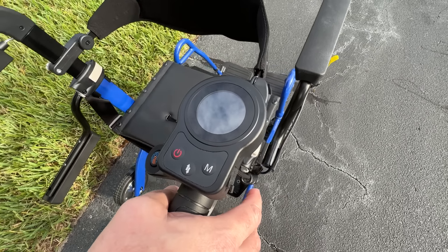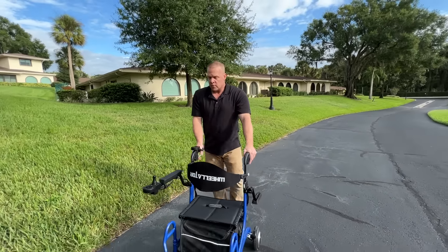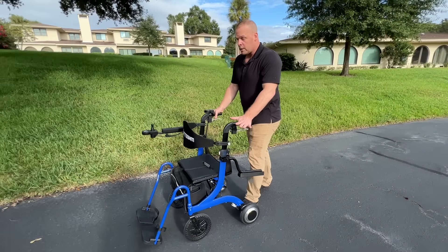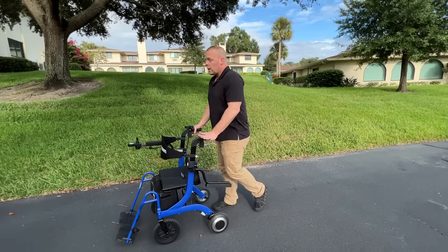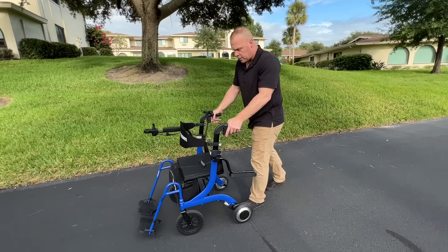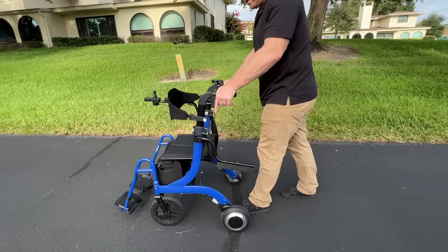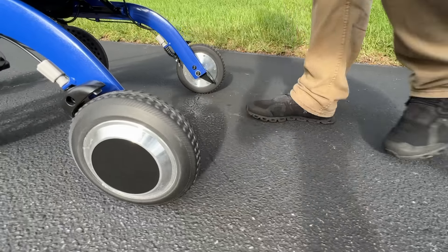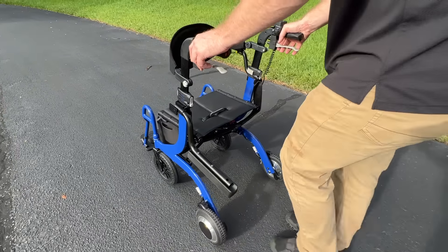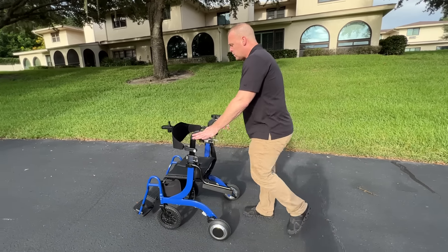Let's imagine it's a beautiful day. It's been raining for the last few days and I just want to use a regular walker. The doctor said it's a good idea for me to be walking and getting exercise, and that's exactly what I want to do — walk as much as I possibly can. You can kind of see this is flat ground right here. Each of those rear wheels has a 250-watt motor in the wheel, which is really unique. So I'll show you a couple things as we kind of get around this corner here.